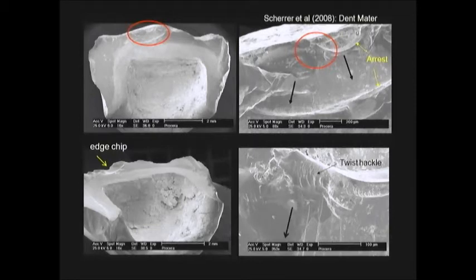the crack stops right here. It never went beyond this arrest line. This crack front was much more powerful, so this is definitely the prime reason for failure, and this is a secondary event. And that's why it's very important before people say, oh, it started from the occlusal side because I saw a chip. No, you need to show me the evidence, which one came first.